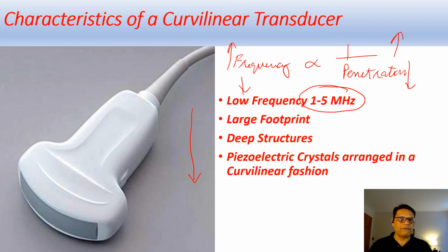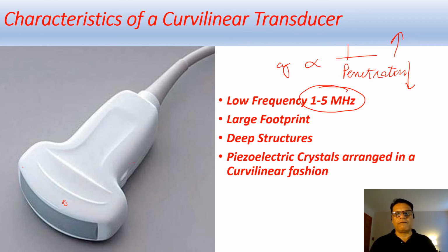And if you see, they have large footprints, and crystals are arranged in a curvilinear fashion. Hence they have better penetration. So we use them to scan or image the deep structures. But there is not always a free lunch. We have to trade off.